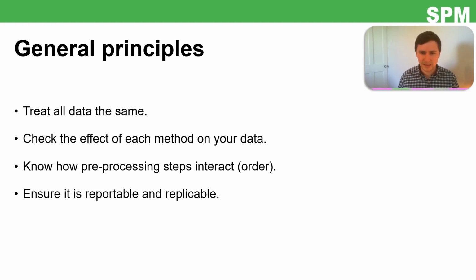And really importantly, ensure that you're able to report what you've done to people, and be willing to defend it, because you'll often find a reviewer will say, oh, you did that, I wouldn't have done that, why did you do it? So you should be willing to justify each step that you take.